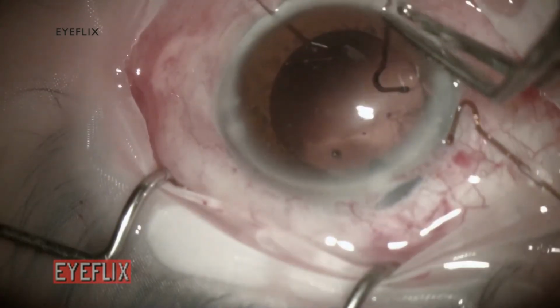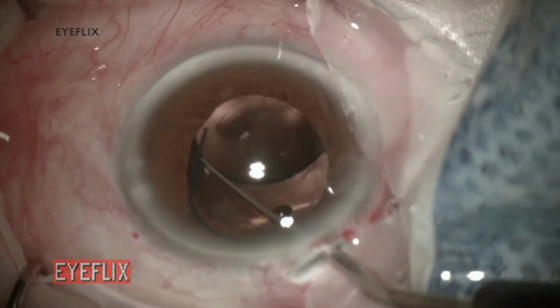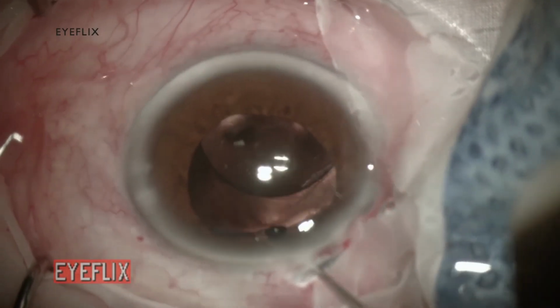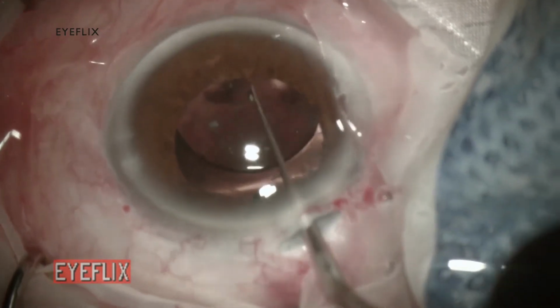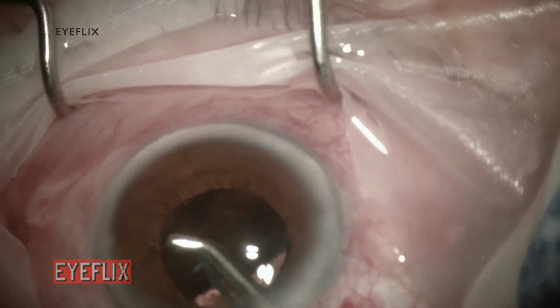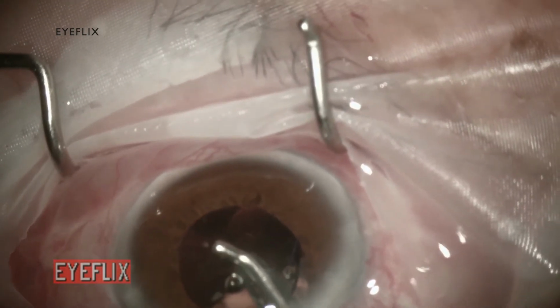I am now removing the capsular bag retractors. For this patient, I opted for a 3-piece acrylic intraocular lens and inserted it inside the bag. Finally, I am aspirating the remaining viscoelastic and ensuring the incisions are properly sealed.